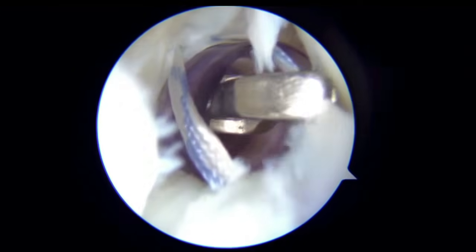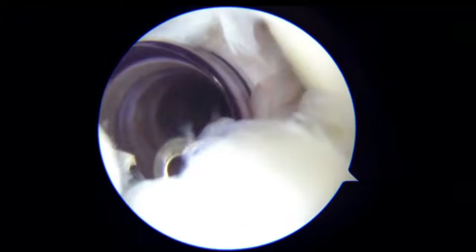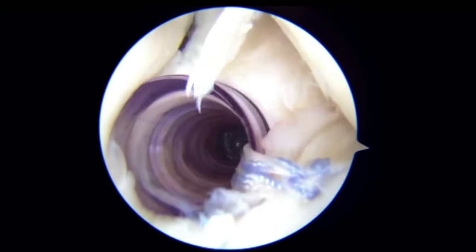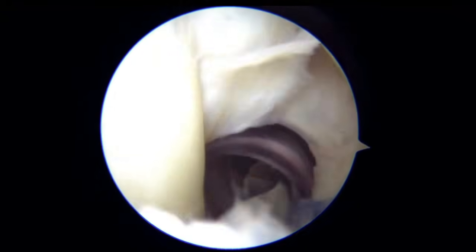This is the second suture that was already parked earlier, taking it out through the cannula, and again the same procedure is repeated. That is, you put the knots, 5 to 6 of them, and then the excess suture material is cut out. So we get a good reduction here.